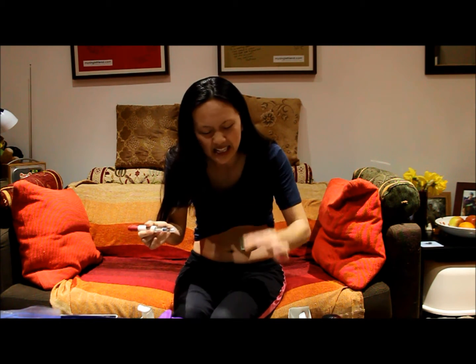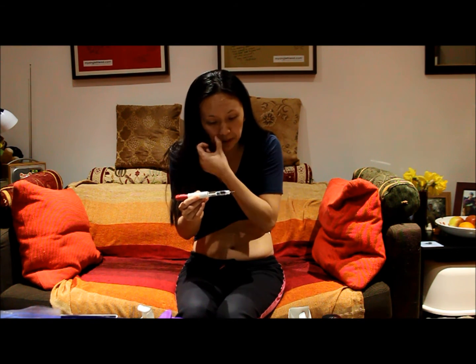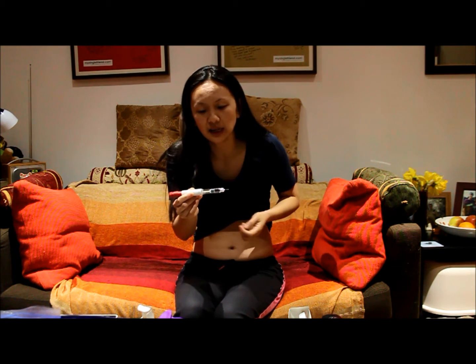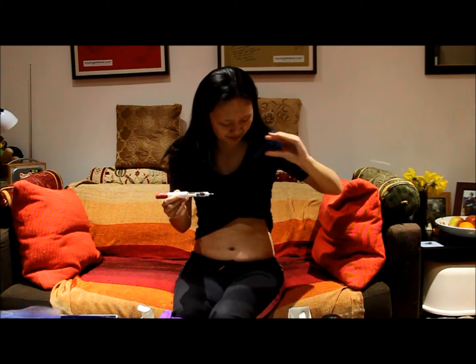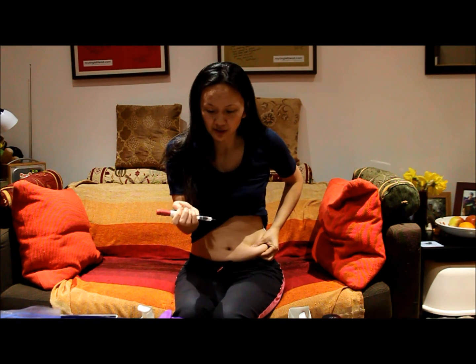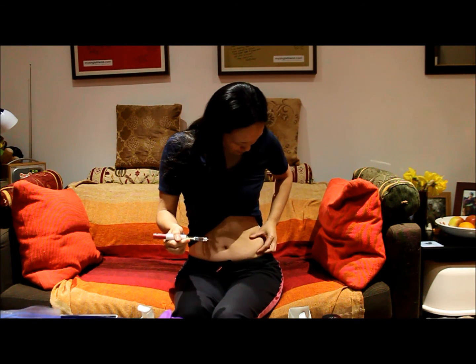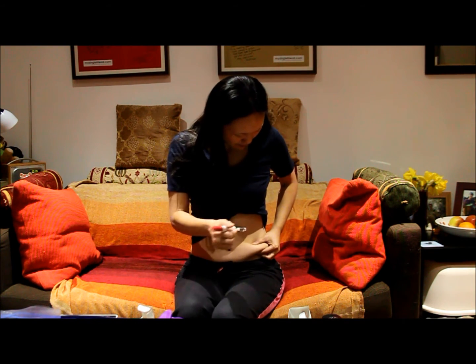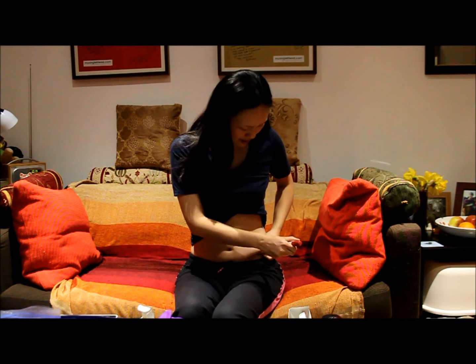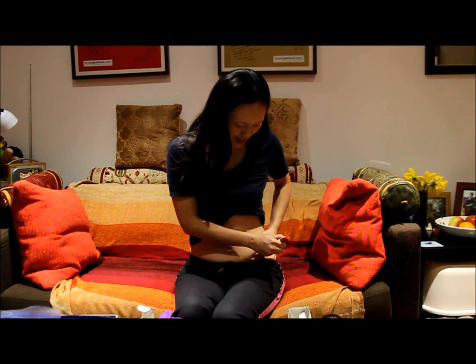I'm going to pull the cap off — so now this is ready. I've dialed up to 300. I'm making my little C-shape with my fingers, pinching my skin, and holding the pen like a pen — however feels easiest. I'm going to go for this spot here at 90 degrees. Three, two, one — and in I go. Remember to let go — let go of your skin.